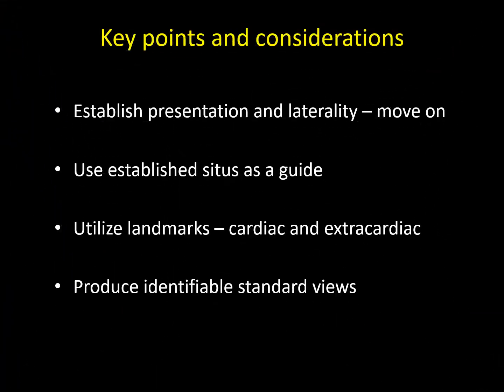Some very important points and considerations during your scan. You want to establish the presentation and laterality in the fetus and move on. Continue your scan. You've already established where the fetus is laying within the maternal abdomen and where the cardiac structure lies within the fetal chest. And you want to use that established situs as a guide for your scan.